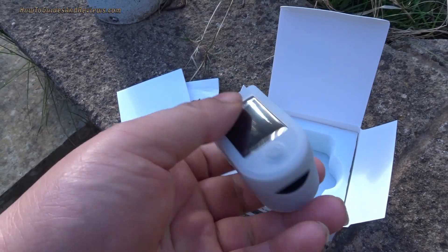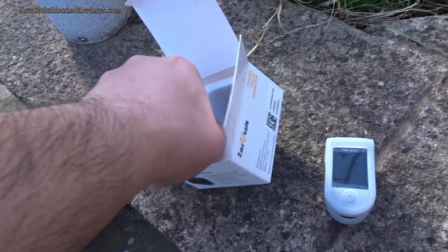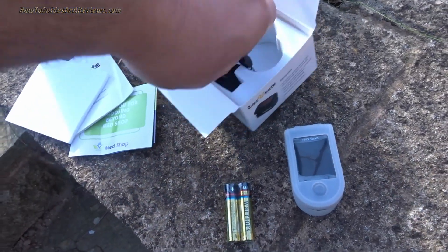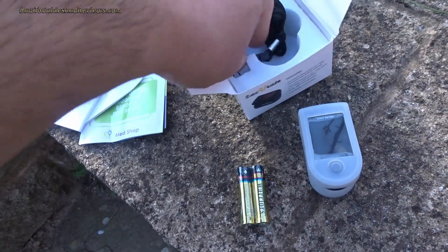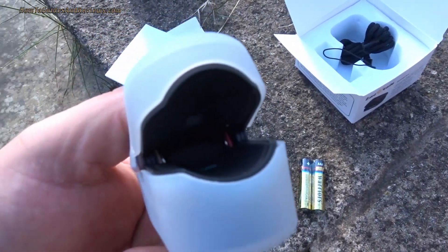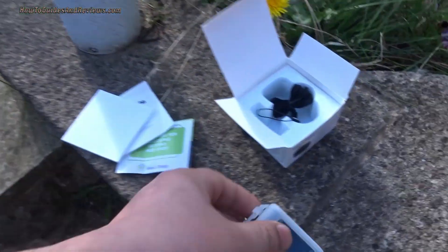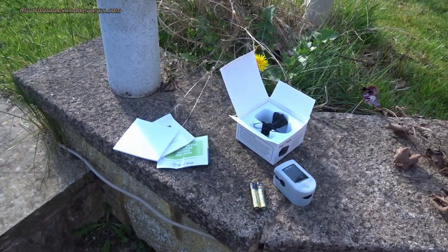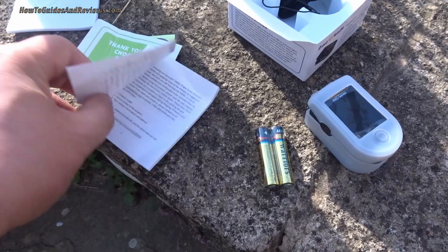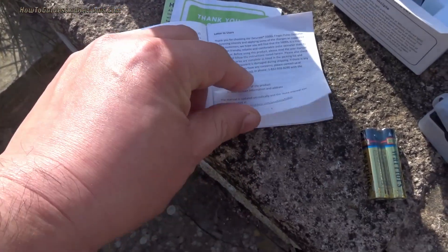First impressions: it looks good. It's got some kind of plastic covering on it which I wasn't expecting. It comes with batteries — that's a good sign. There's also a lanyard to hold it with, some plastic covering, and that's where you put your finger. The instruction booklet is in English and the text isn't so small that you can't read it — that's another good sign.